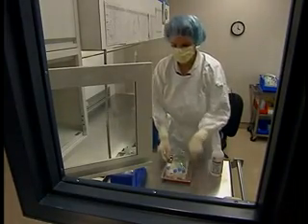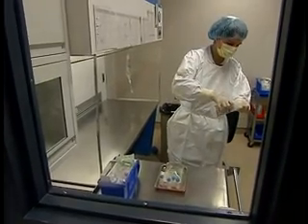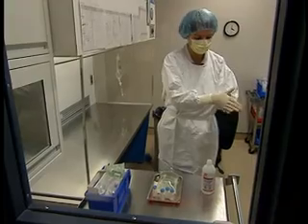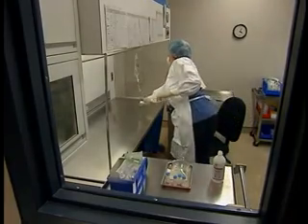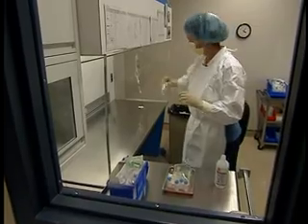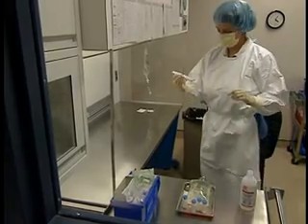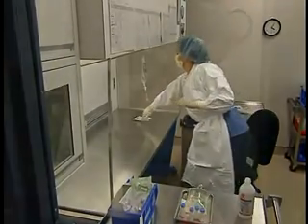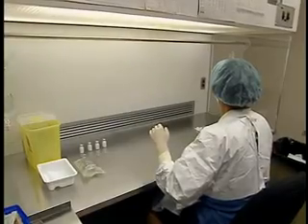Bring the tray close to the hood and add anything else needed to the tray. Do not introduce anything in the hood yet. Disinfect your gloves with alcohol. Place your supplies and the medications under the hood, checking them once again to make sure they are what you need and that they are perfectly intact. Place only required materials in the hood and avoid as much as possible placing anything that is not sterile under the hood. Disinfect your gloves again. You are now ready to begin aseptic manipulations.